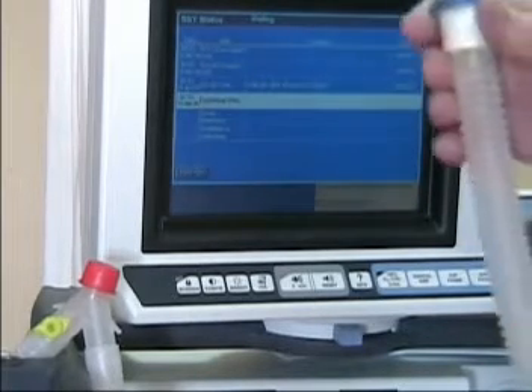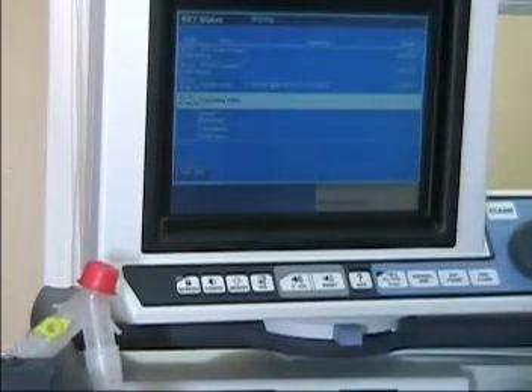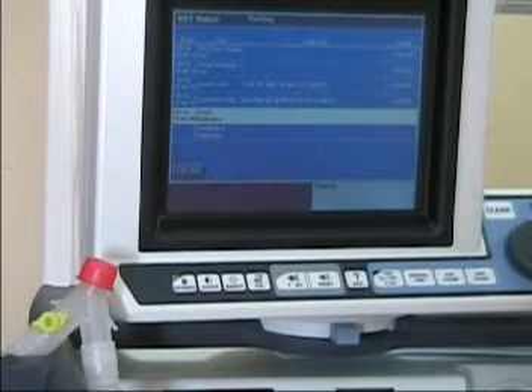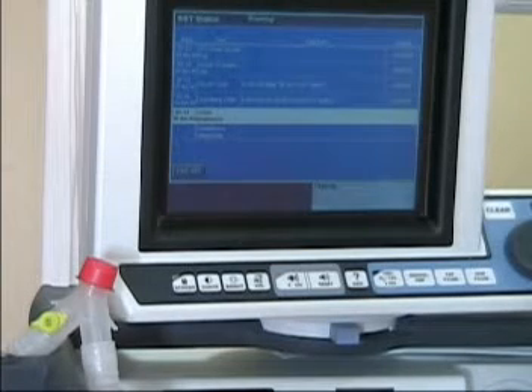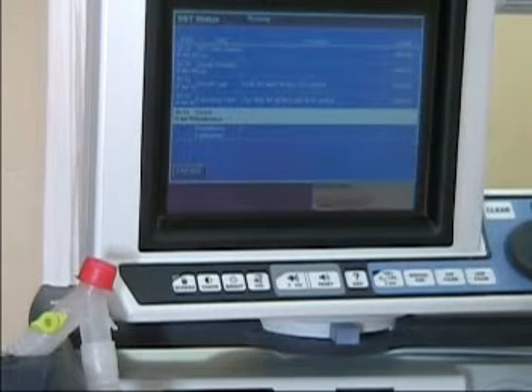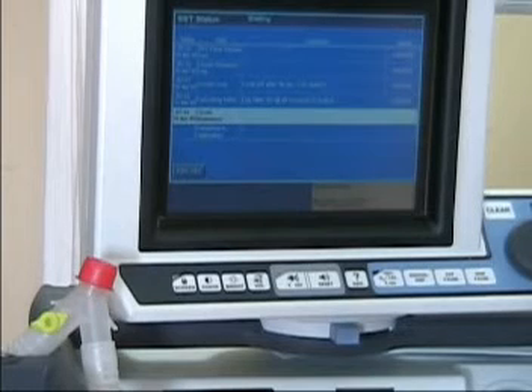It says connect the patient, so we're going to connect this back to the machine. Press accept. That has passed, and now it's checking the resistance of the circuit by sending different flow rates through. So far four out of six have passed.